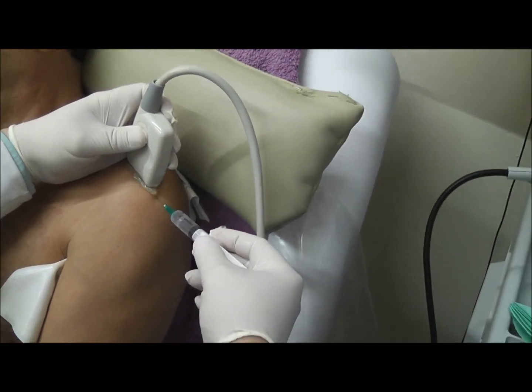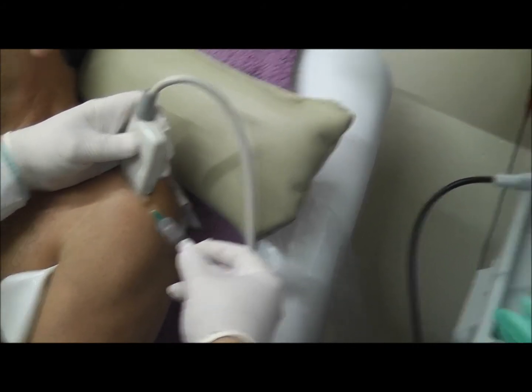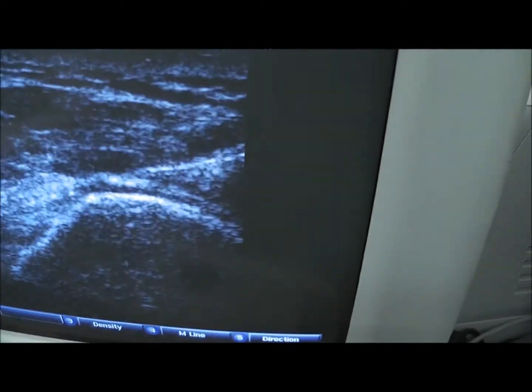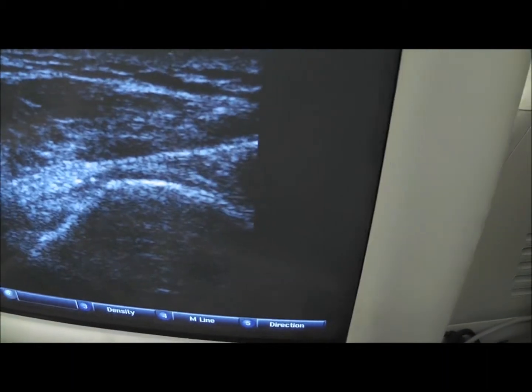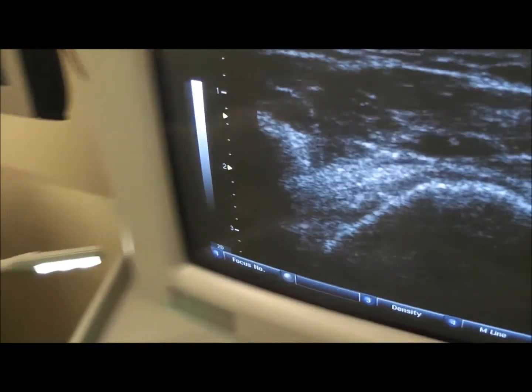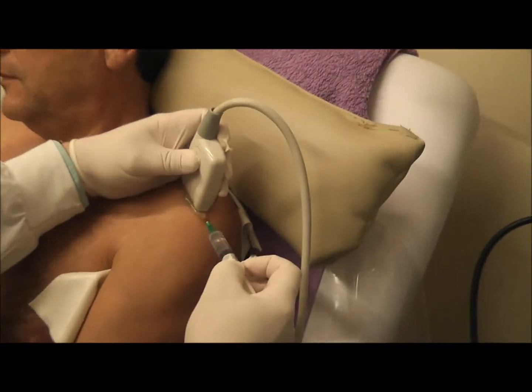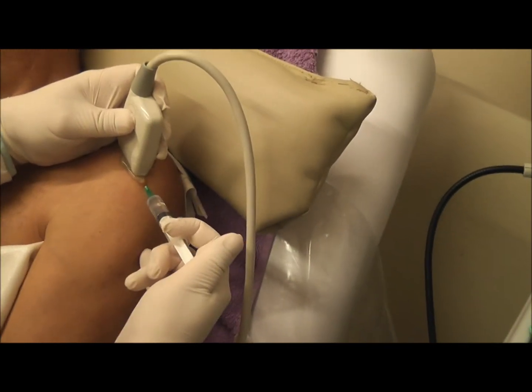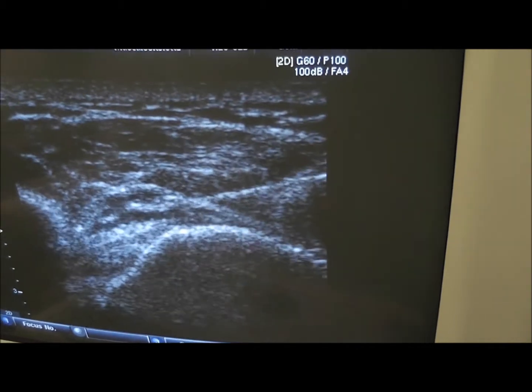The needle has to be parallel. You can see the needle there. Now we aspirate in this subacromial space, and you can see that the space is distended because of the injection.